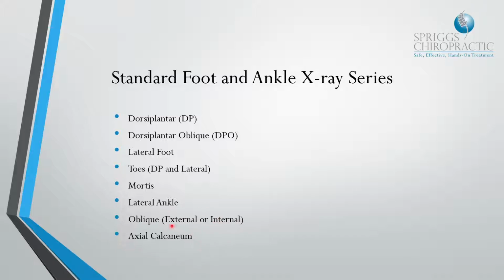Then there's the axial calcaneum projection, which we're not going to go through today because it's not the most commonly used projection anymore, but it is available to you, and if you look it up in your textbooks you will come across this view. With the particular X-ray equipment that we have in our facility, this projection is not the easiest to achieve, so that's one of the reasons why we're not going through it today.